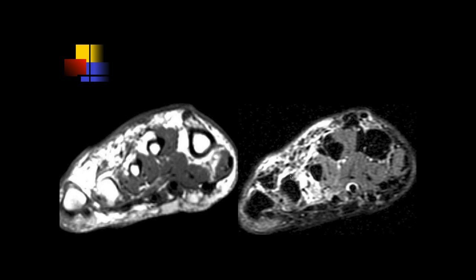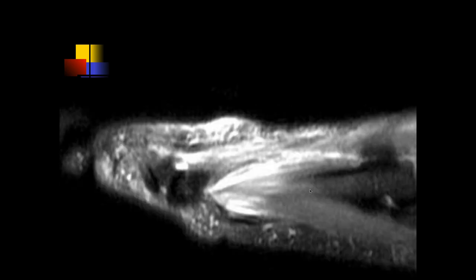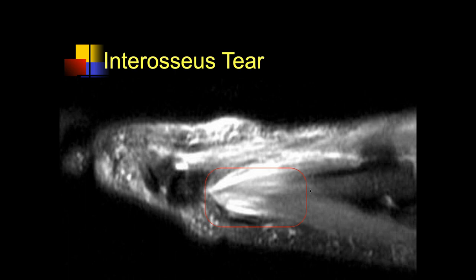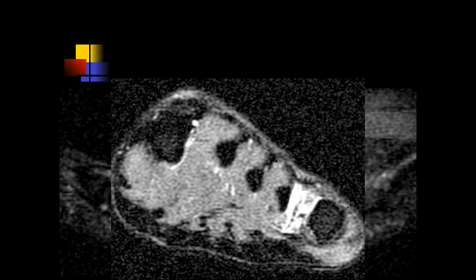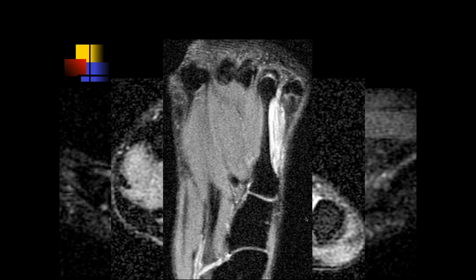There's fluid signal intensity between the fourth and fifth metatarsals — this could be intermetatarsal bursitis or muscle strain of the interosseous muscles. Here's the T1, here's the STIR sequence, and here's another interosseous muscle tear.